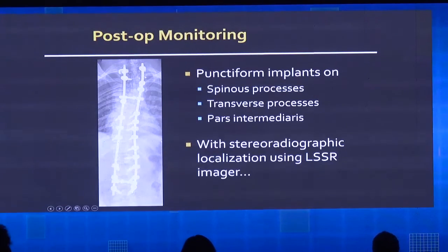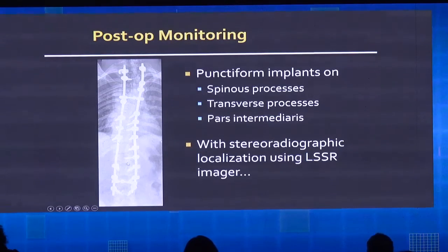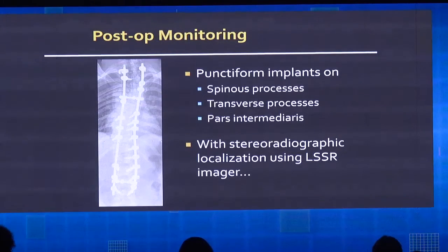In terms of post-op monitoring, EOS is also nice. If you look very carefully, you should be able to see some very small lead points which are on the spinous process and others which are on the transverse and on the pedicles. The general idea is that when you monitor and repeat the X-ray, because of the biplanar acquisition, AP and lateral, you will have the possibility of doing stereoradiography and to be able to see if the implants are moving relative to each other, which would imply some failure of the fusion. But it's still very much a work in progress.